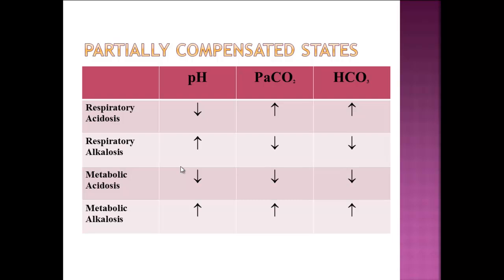The metabolic acidosis, we're going to see the pH down, the HCO3 down, which confirms a metabolic acidotic state. And then we'll see the carbon dioxide level working in a manner lowering that should reduce the acidotic situation.